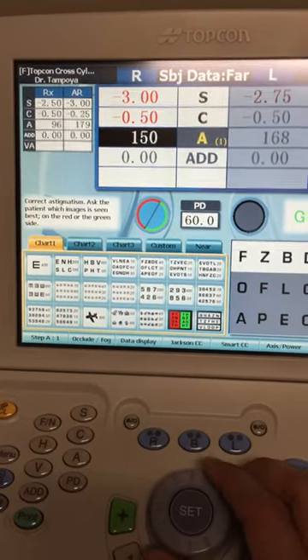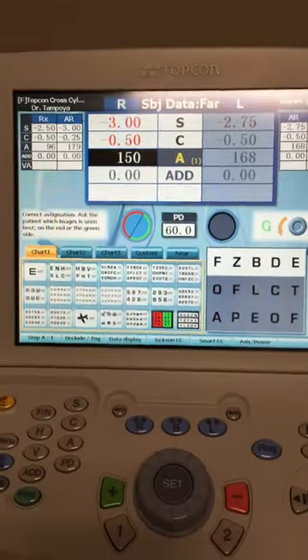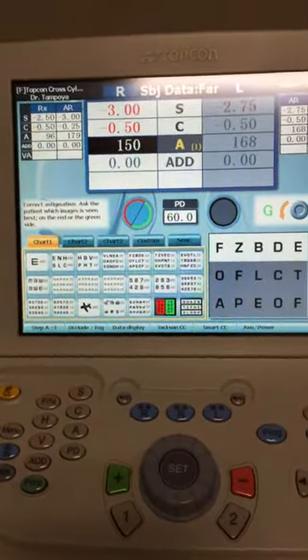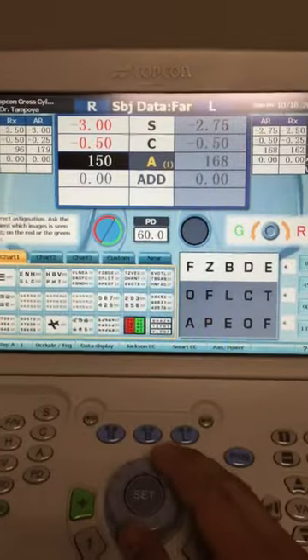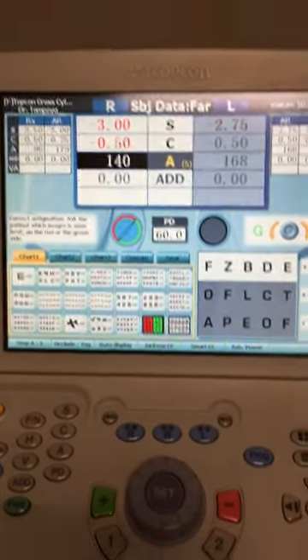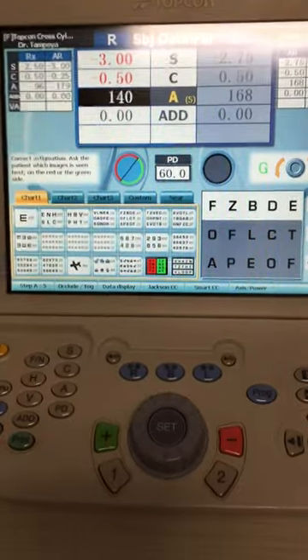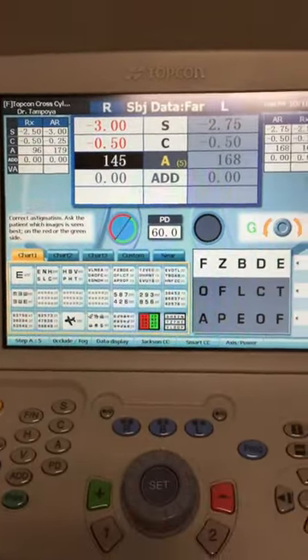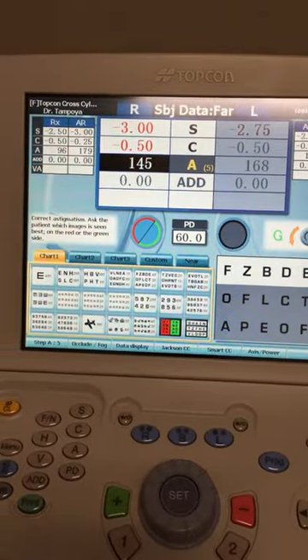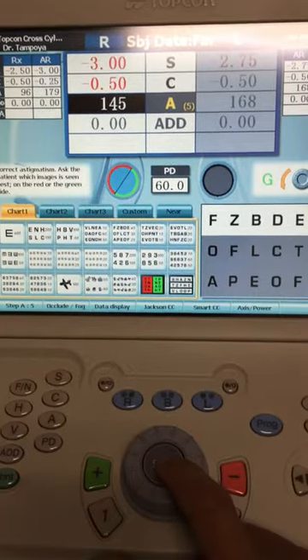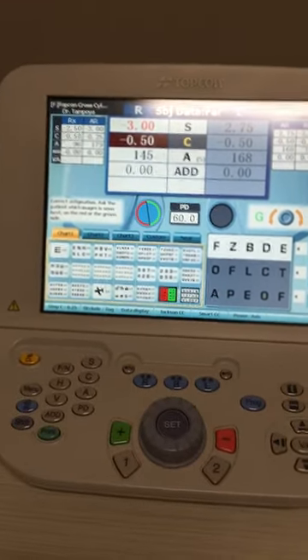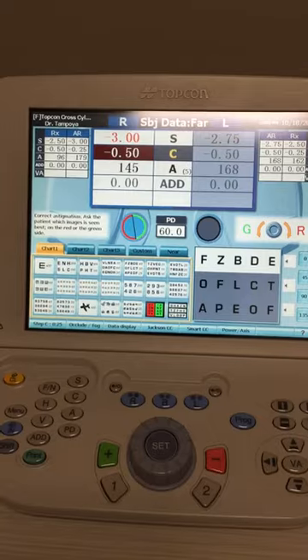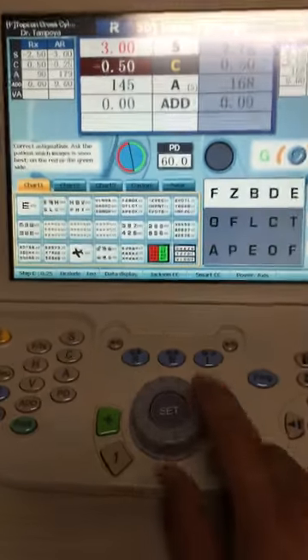If you want smaller increments, press the STEP A button and it changes to one degree per step instead of five. After moving the axis, if the patient says red is clearer, narrow it down — go from 15 degrees to 10 degrees by moving two steps. Verify it's on 5-degree steps and ask again. If they say green, do one step in the green direction and stop to narrow it down. Press SET when done with the axis — it'll move up to the cylinder. Ask which side is clearer; if they say about the same, press SET again.